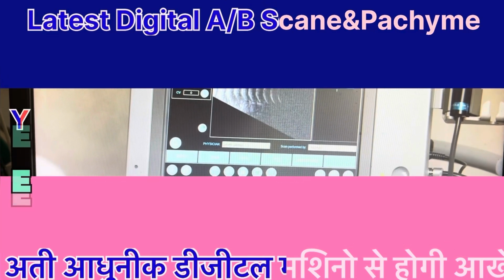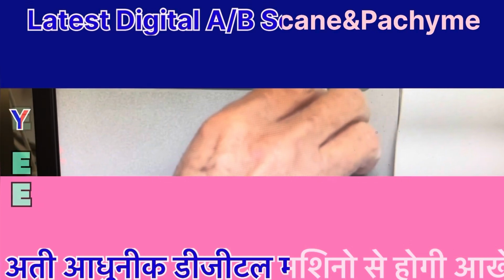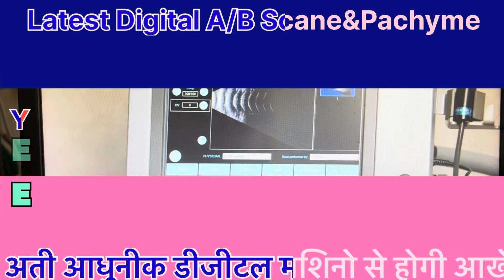Touching the CVA transfer button at bottom right adds the measurements from the selected scan into the result table. Selecting the B-scan icon activates the B-scan function.